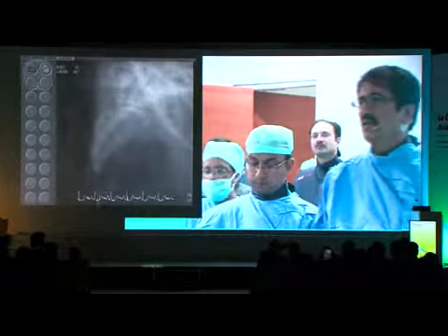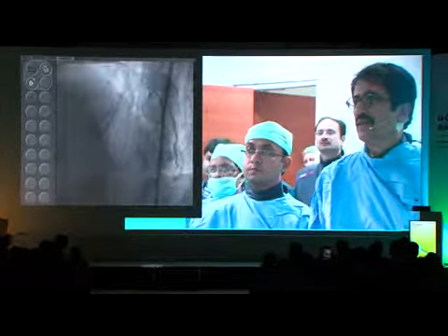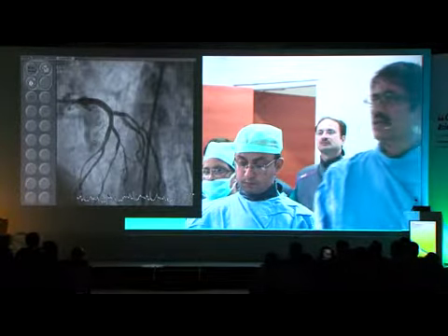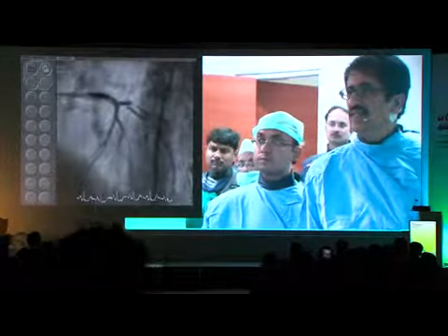Good, Suresh. I think this was a very nice demonstration of the bifurcation stent, and also of your drug-eluting balloon, 2-in-1. So I think we all appreciate that, and let's give the team a hand there. Thank you indeed, and we would continue to talk to each other from Cath Lab.